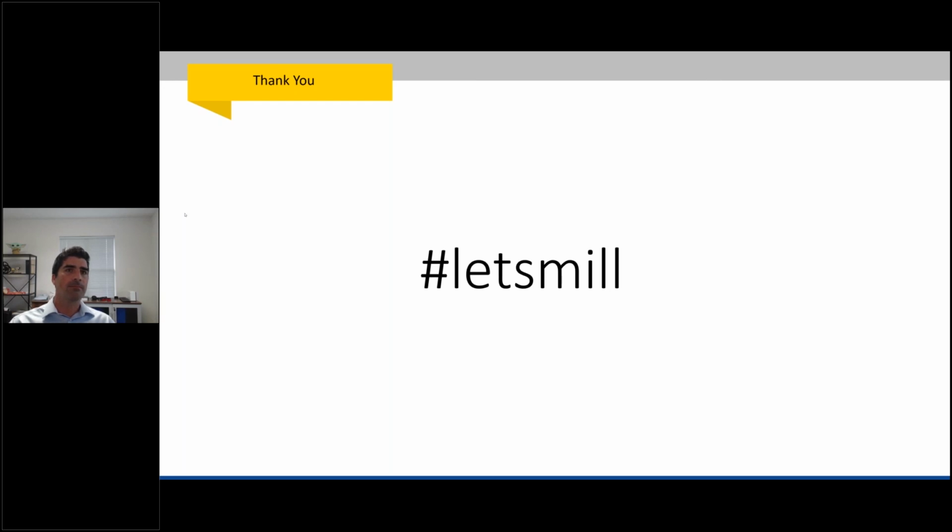Excellent. The next one is, what is the timeline or turnaround time from when a lab requests an update from Zahn to getting the update enabled on their Millbox? Oh, that's an awesome question, because I think the assumption there is that I don't want it to take long, right? Labs are in a hurry. We're all in a hurry.